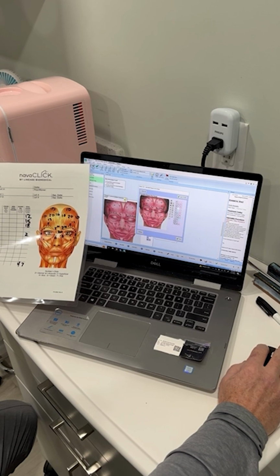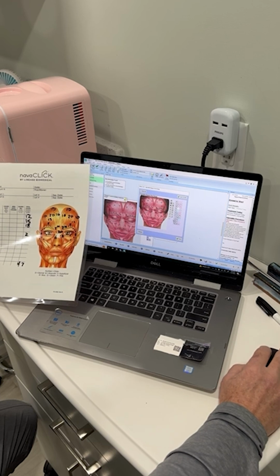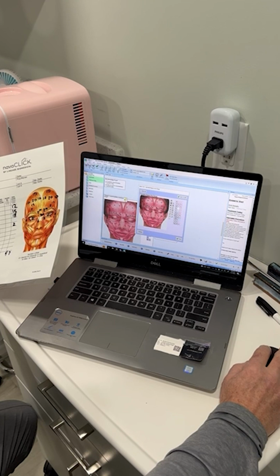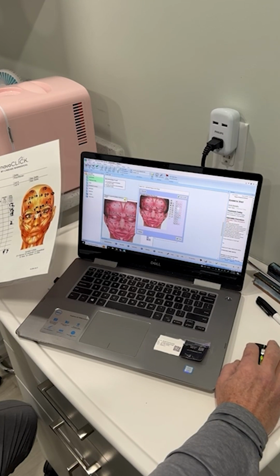Then I'm going to do 2, 1 in the jelly roll, 3, 2, 1 in the jelly roll, and then I'm going to do 2 in the dermis here, which I charted on my face sheet here, and then 1 superficial laterally in those extended crow's feet to try to soften that a little bit.